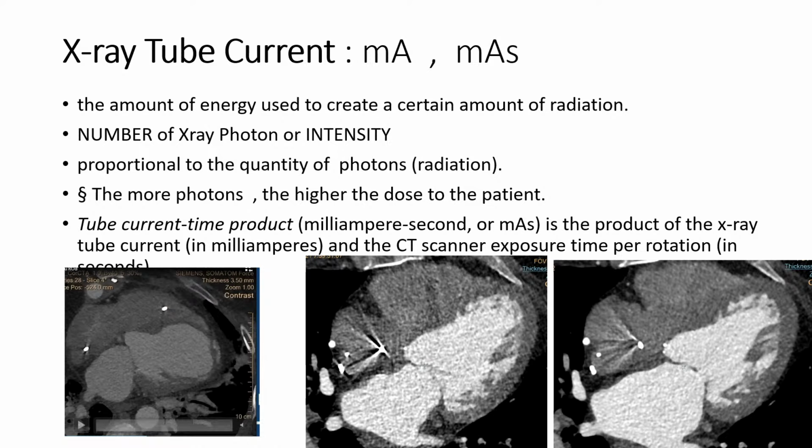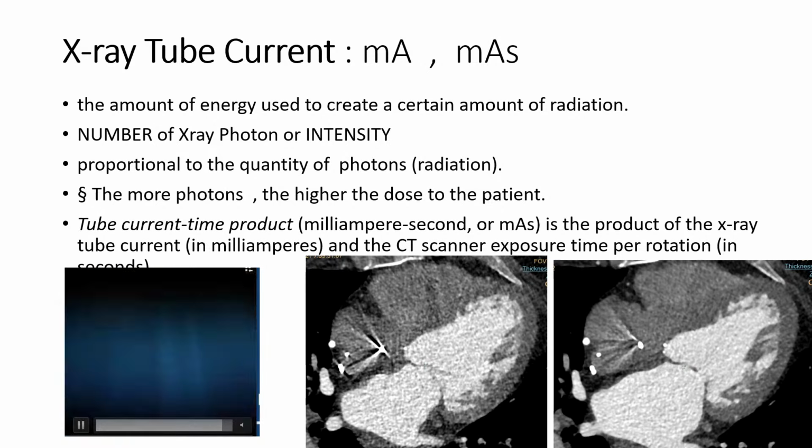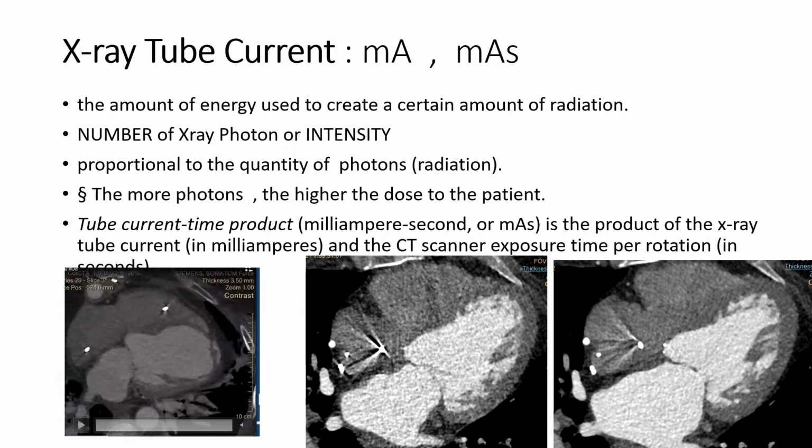So you can see here, in these images, this is a patient who had a study done, and the images were acquired throughout the cardiac cycle. You can see at the beginning it is very blurry. Okay, it's called dose modulation. So in the beginning of the cardiac cycle, we apply very little MA, so you can see that it's very grainy, right? So, for instance, here, this is a patient who received lower MA compared to higher MA. Better contrast, better image quality, but higher radiation.